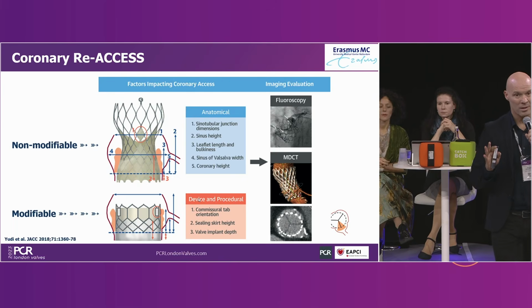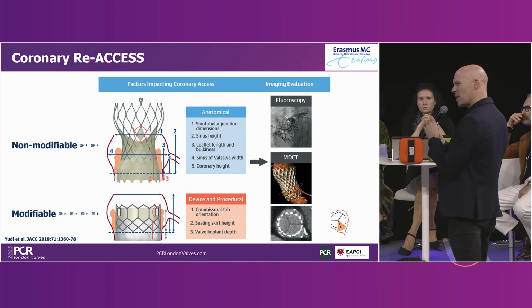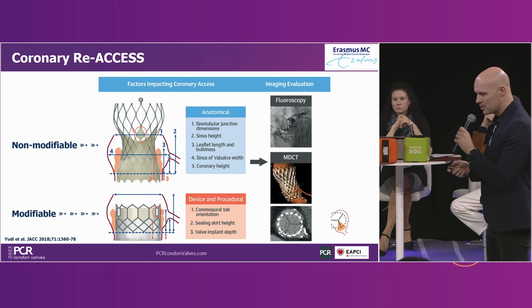I will get to that in a second. The third important part is the height of the coronaries. We all know low coronary heights, those are the difficult ones. Coronary height below 10 millimeters, that's a matter of concern. It's not impossible, but then it will definitely affect my valve platform selection.